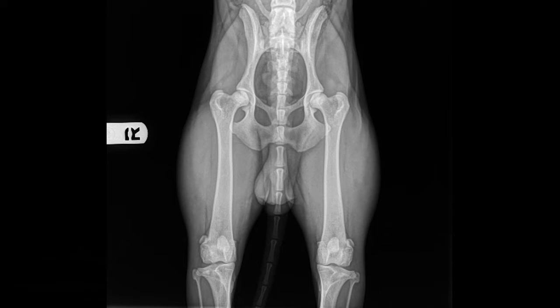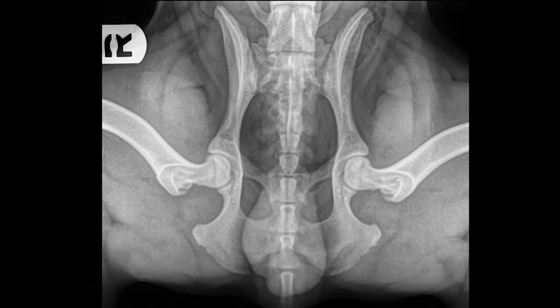The next two shots, like we talked about, are specific to PennHip, and they revolve around laxity. So this is that compression view. You manipulate the legs so that the knees are bent over the dog, just like if they were standing or walking, to fully seat that femur into that socket so that you get your baseline of where you are starting.